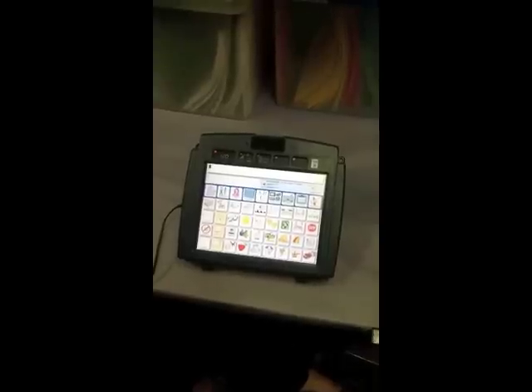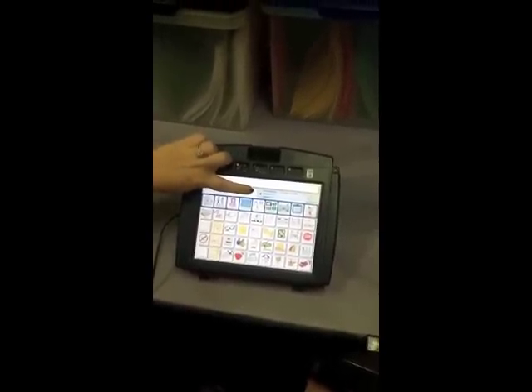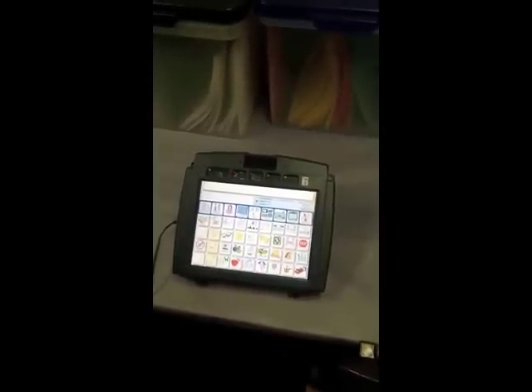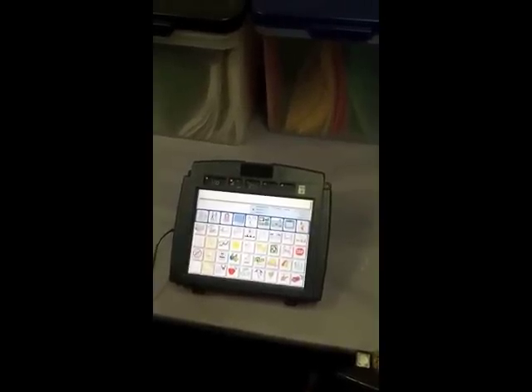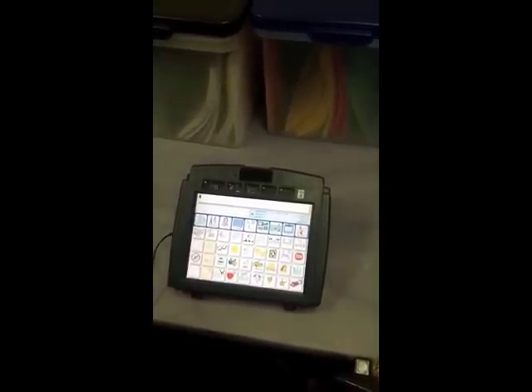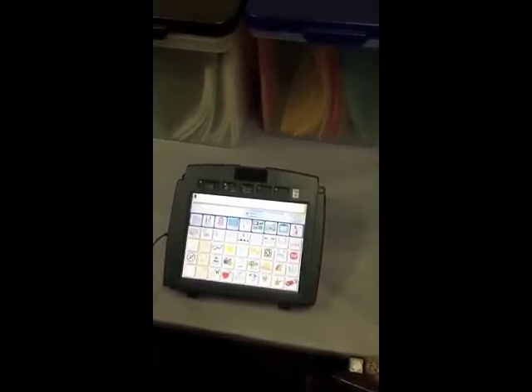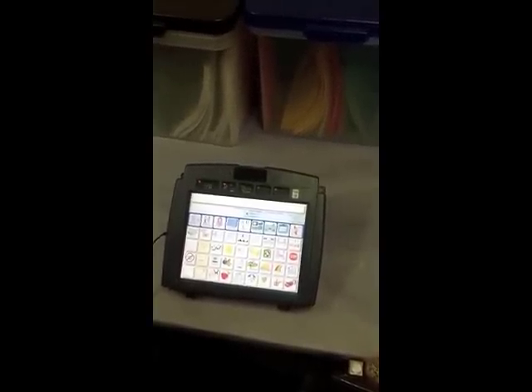You can identify when the battery is fully charged when the graph has mostly blue-green lines. A few yellow and red lines may be present. It is important to identify when the battery is low because you cannot store information when this is the case. When there are only yellow and red lines present, the battery is low. When there are only red lines, the battery is almost dead and the device will be shut down. With this being said, the device should be plugged in when there are no green lines left in the graph.